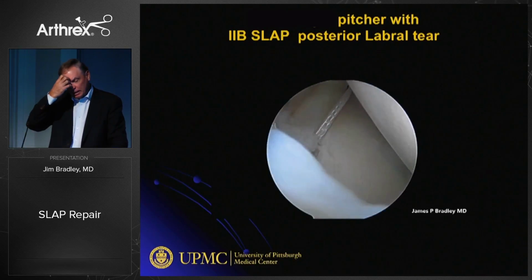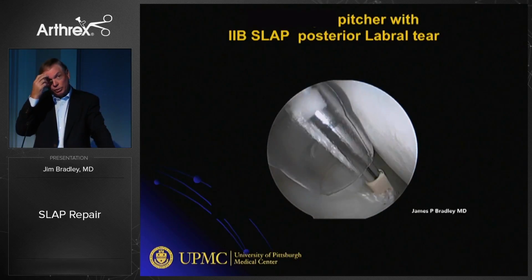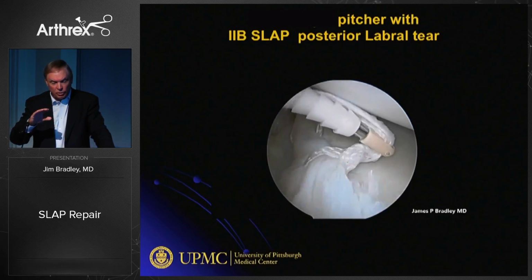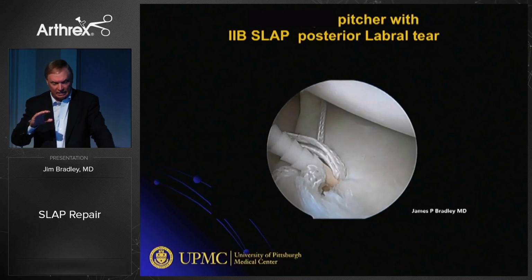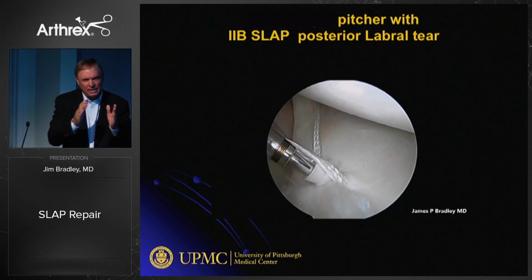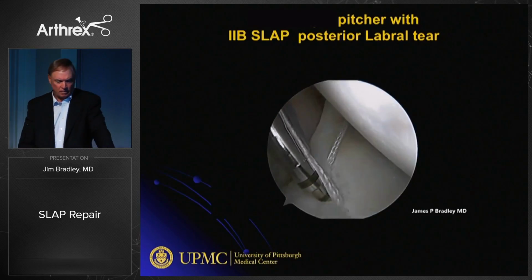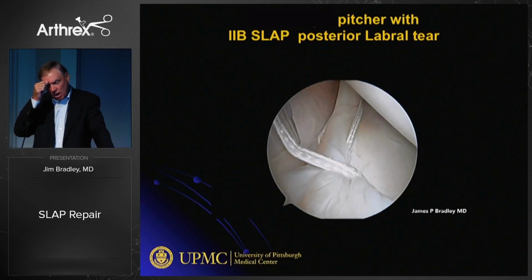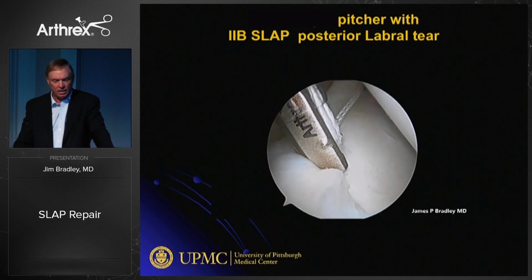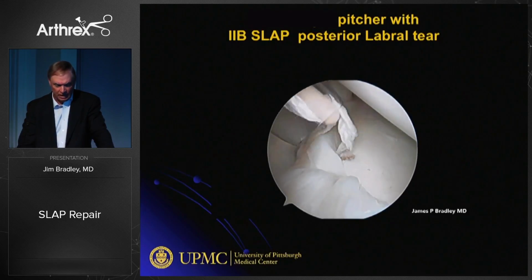Anyway, I drill it, and then you got to leave a little room for the labrum. So this is a short 2/9 push lock. So you got to leave a little bit of room on it. Don't strangulate the thing for the labrum, all right? That's one of the keys. So you kind of say, well, how big's my labrum? And then you'll make sure that the cutter that he talked about, you want to spin the cutter. See, I spin the cutter and I shove it in the hole. That way, none of the suture's above it. So we're going to move on here for time's sake.